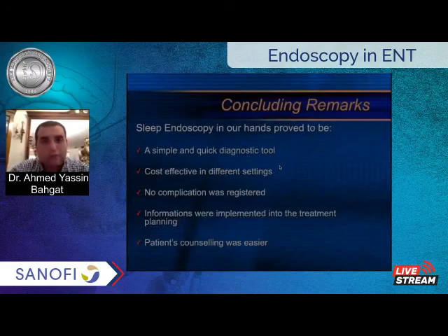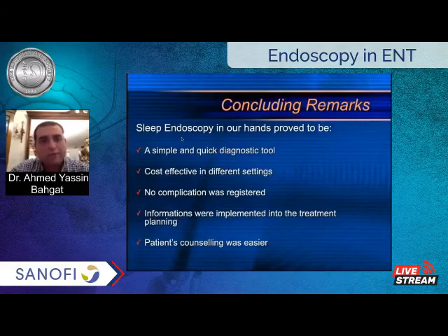Finally, to conclude, sleep endoscopy in our hands proved to be a simple, quick diagnostic tool, cost-effective in different settings. No complications were registered. However, don't do sleep endoscopy in your clinic. We do it in the operating theater, with the anesthesiologist giving the propofol. We have the tube and the laryngoscope available at the time. We can intubate the patient at any time, but we didn't have any problem of airway obstruction during sleep endoscopy.